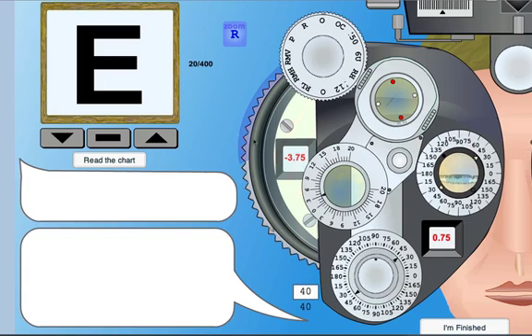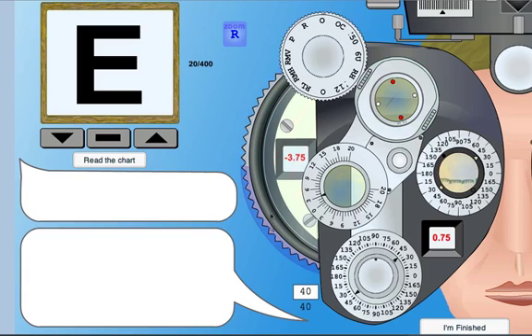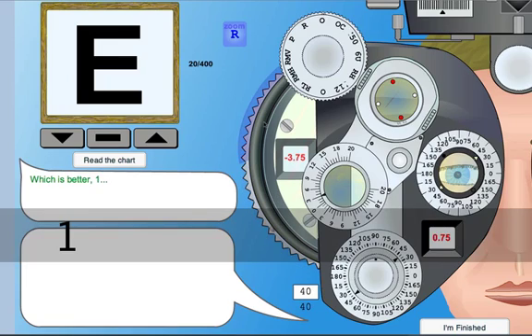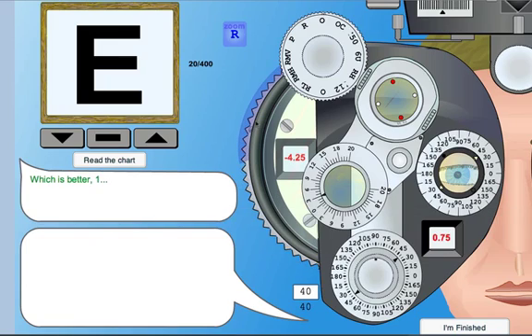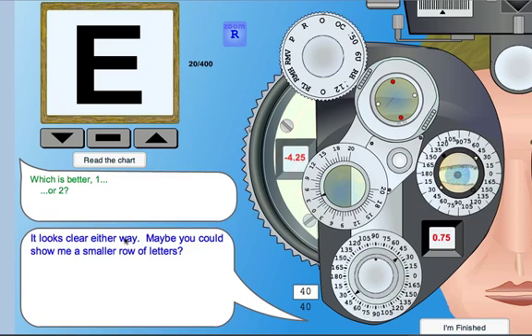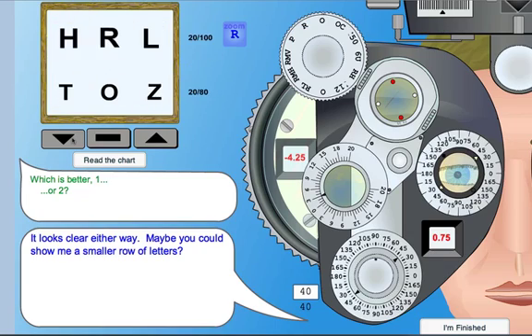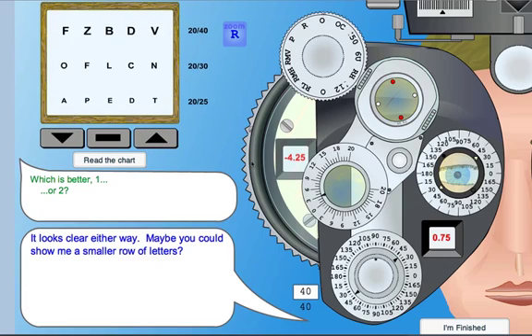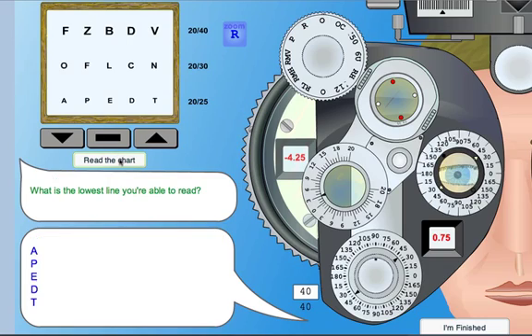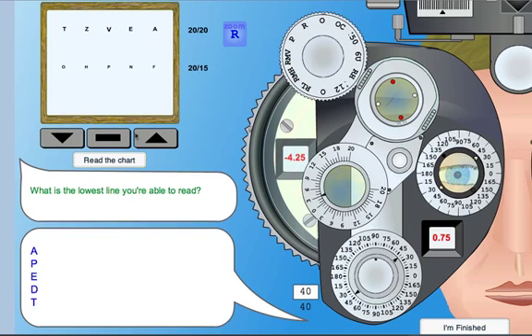You ask questions, and of course the patient can't hear you on this simulator, so instead, when you give choices, you just press the 1 and 2 button on the keyboard. So you say which one's better, number 1, and press the number 1 key on your keyboard, or number 2 — and they say it looks clear either way. Maybe you could show me a small row of letters. Rookie mistake — we probably should measure the vision first. Since they have a prescription in here, we'll just ask them to read the chart with this. They're reading 20/25 already. Read this chart — can't read any of those.